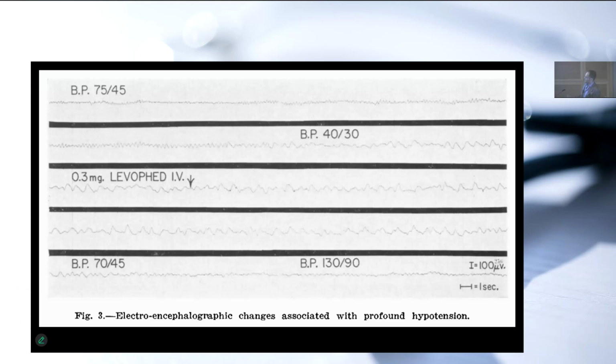So the observation for them here is, well, hey, this is largely indistinguishable from this, but we didn't have any way of knowing that. Most of us would say, okay, that's not really a good blood pressure. That's probably not going to support adequate perfusion of the brain. But clearly at the level of the EEG anyway, the cortical neurons are just as happy at 130 as they are at 70 or 75. So they were impressed by the fact that the EEG was able to show them things that they could not know otherwise, or confirm that bad things are truly bad and reversible, which is nice.